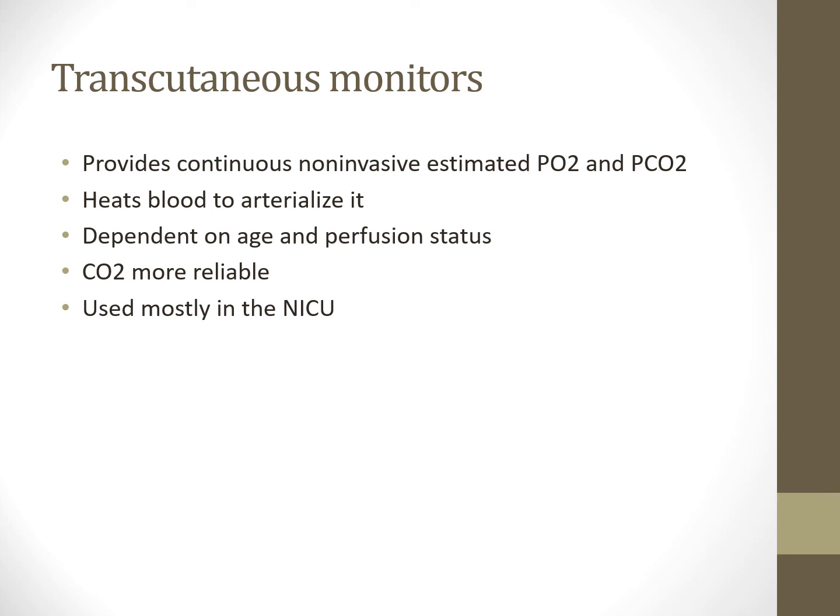It's also a good sign of hemodynamics, right? You got a patient that's in severe sepsis, put them on end-tidal CO2 even if they're not intubated yet, because that's a sign of perfusion, and as the end-tidal drops, that's a sign that they're getting worse, and that's a sign that we may need to start looking at things that would help their hemodynamics more effectively. So invaluable tool, that end-tidal CO2.